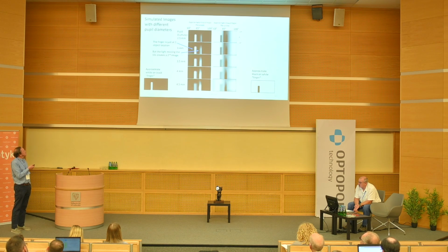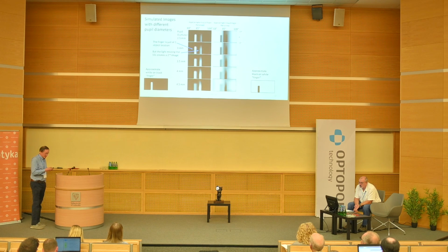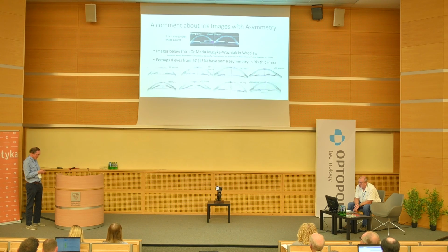And this is the variation of pupil size. Bothersome peripheral dark shadows are always with a small pupil, and probably with bright illumination, which is more this situation up here, where you can see a very distinct shadow, whether or not you see the double image. With other patients, this patient wasn't complaining.